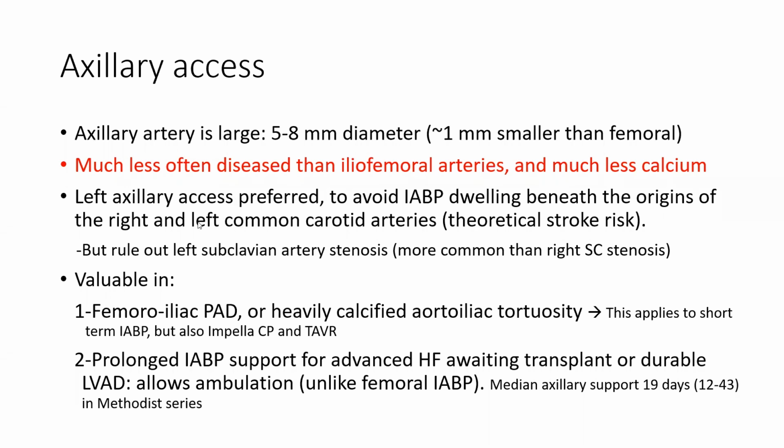When is axillary access valuable? There are two instances where you need to consider it. One, femoral-iliac PAD or heavily calcified aortoiliac tortuosity. In this case, you need to consider axillary access even for short-term balloon pump or even Impella and TAVR. And the left axillary access is particularly favored for Impella CP and TAVR because it mimics kind of the femoral approach, the anatomy and the curvature of the femoral approach.